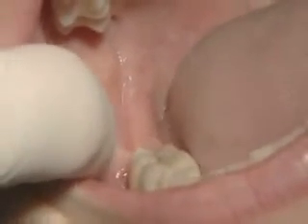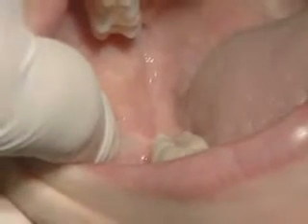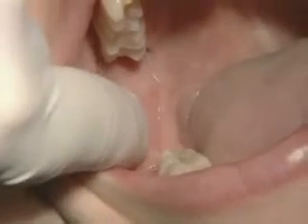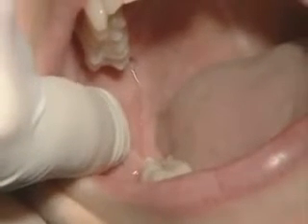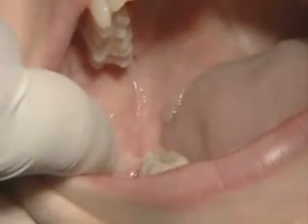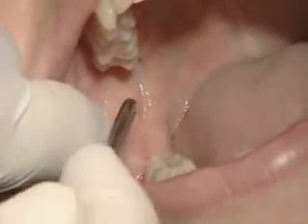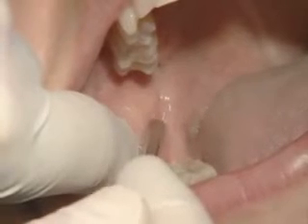The patient needs to open her mouth wide. The first point palpated is the anterior border of the ramus, and specifically the coronoid notch of the external oblique ridge, where my finger is resting right now. You then move your finger in medially to feel the internal oblique ridge — it is just medial to this point where the needle will be inserted. By retracting your finger laterally again and resting on the external oblique ridge, you expose the pterygo-temporal depression, shown at the end of the probe here.